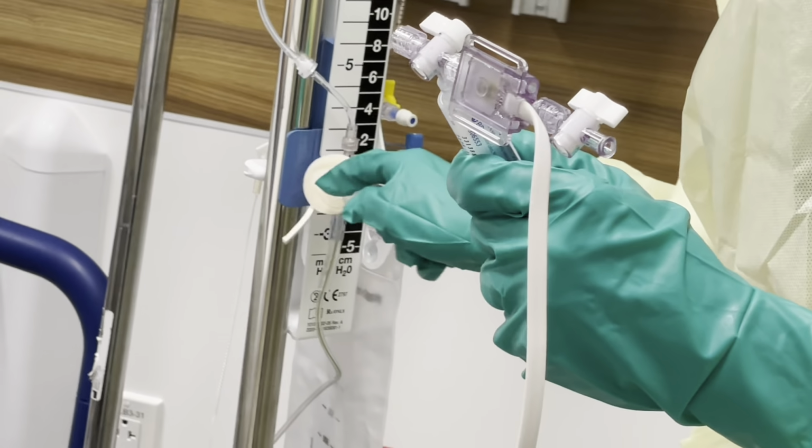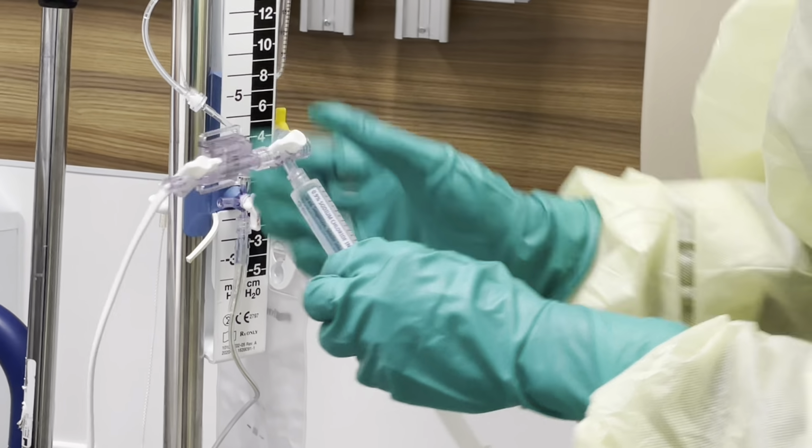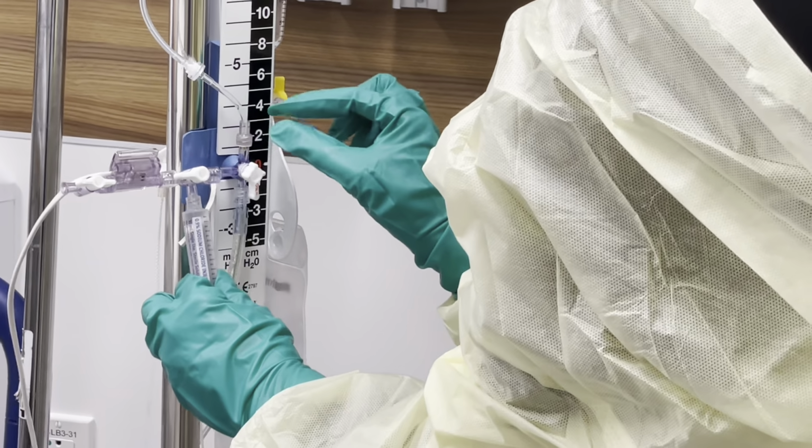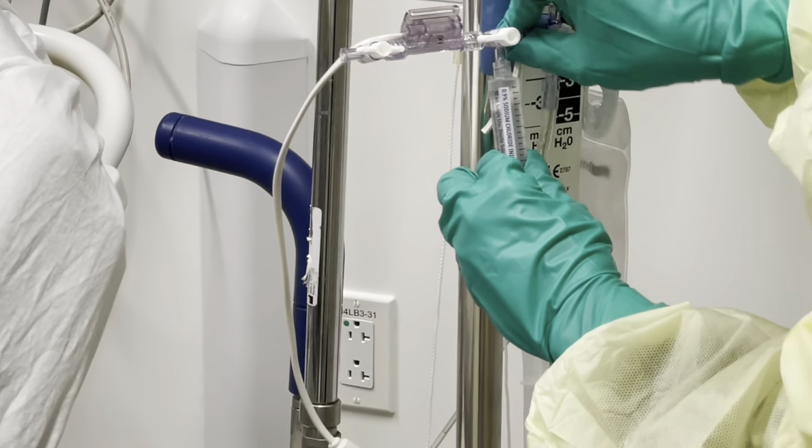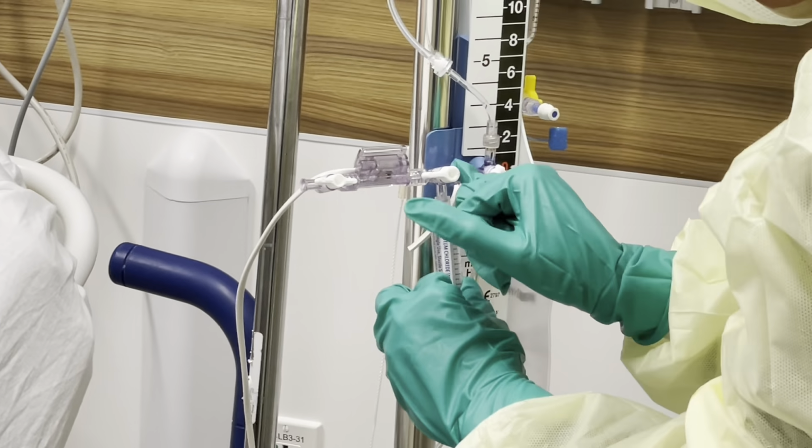So we'll give that a few seconds to dry, 30 seconds or so. Now we have our caps. We have this off to our patient, obviously. We have that open. You're going to be able to take this, it's going to twist. So the goal here is to twist this onto here. Nice and sterile. Okay, you haven't touched anything else. This part's still sterile. Now you can turn it off to your drain here.